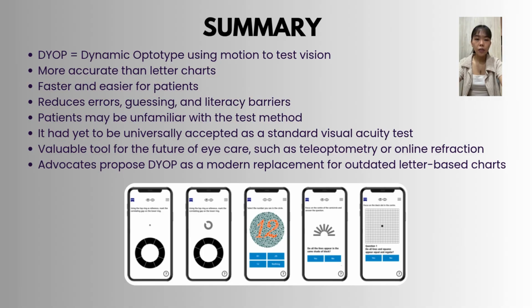It is not yet widely used by optometrists as the main test. Its future potential is that it could become a standard tool in optometry. It is useful for remote testing like tele-optometry and online exams. It is seen as a possible modern replacement for the old letter chart.